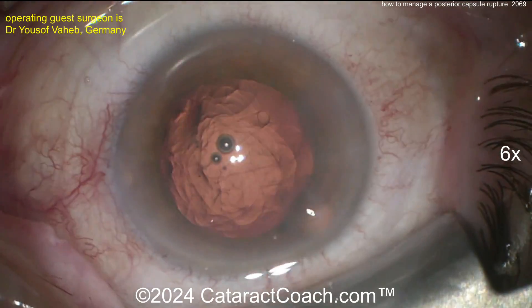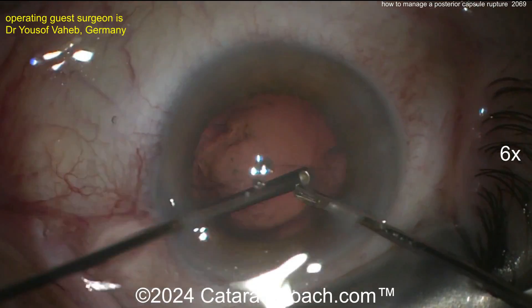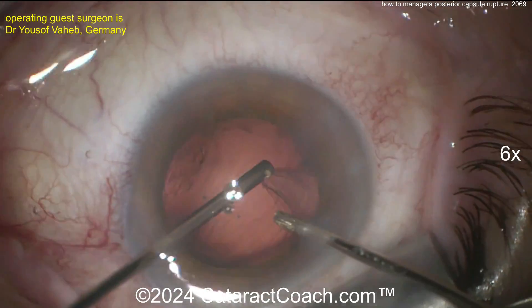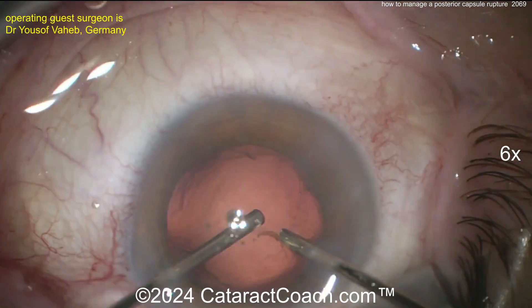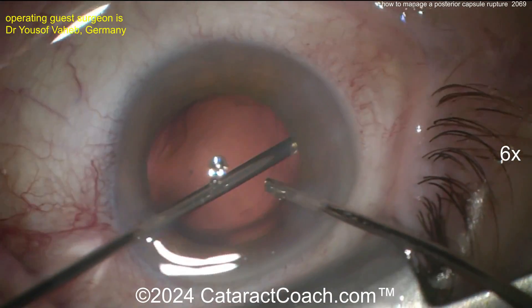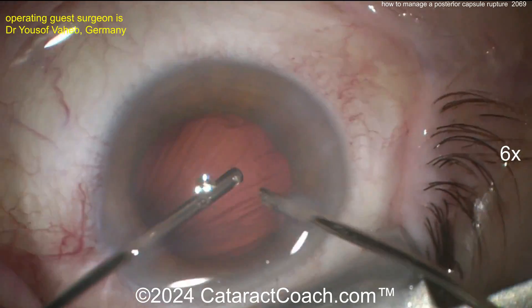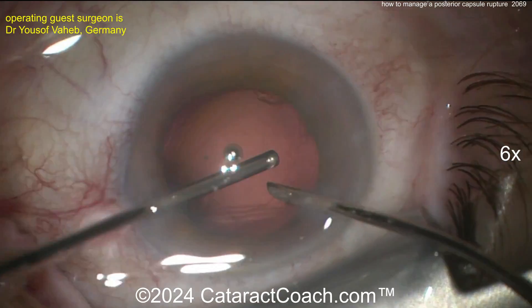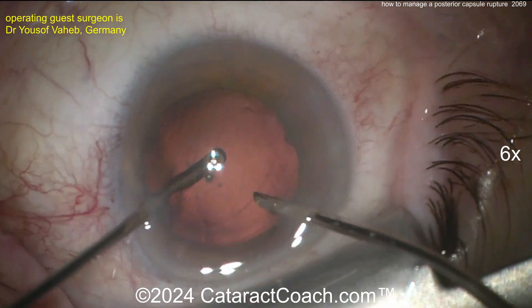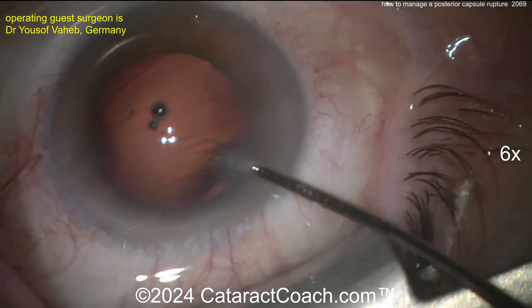Cleaning up the vitreous — the viscoelastic is already out of the eye. Here's where I'd really want to stain it with triamcinolone, but experienced surgeons may not need much staining. Now removing the residual cortex — this is I&A cut: position one is irrigation, two is aspiration, three is the vitrectomy cutter. Or if you're afraid of damaging the capsule, you can go to cortex removal mode, just I&A mode, so it won't engage the vitrectomy cutter.